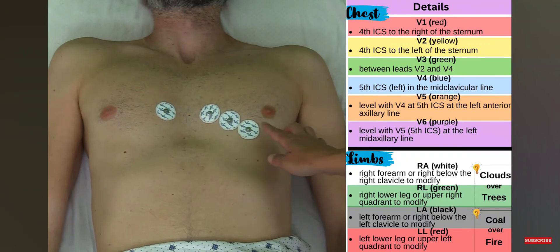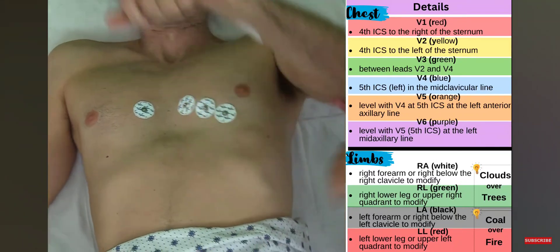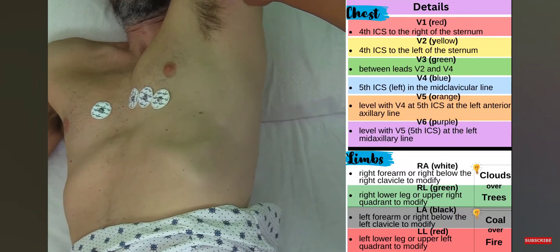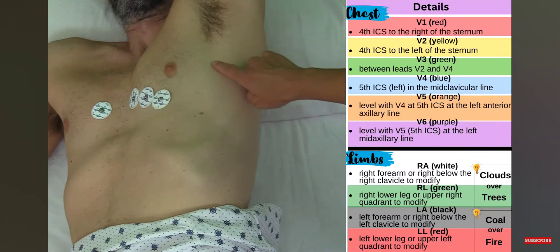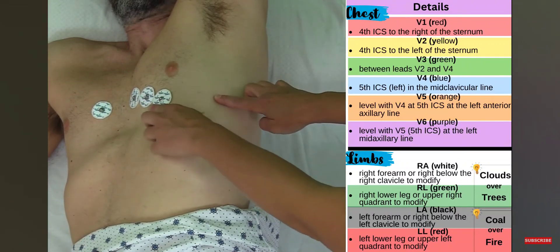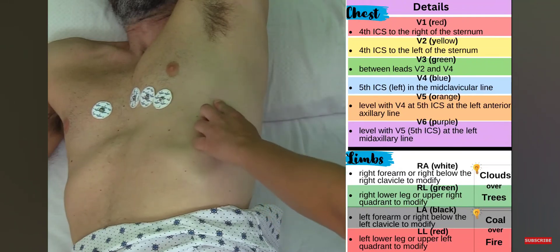Now I'm placing V6, again temporarily skipping V5 because V5 goes between V4 and V6. V6 needs to be at the mid-axillary line, level with V4. I'll have you turn to your side a little bit — mid-axillary means midway through the armpit — and I'll place V6 right here, level with V4.